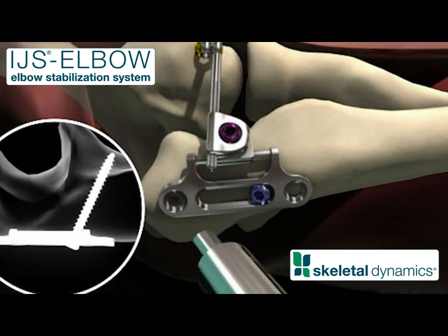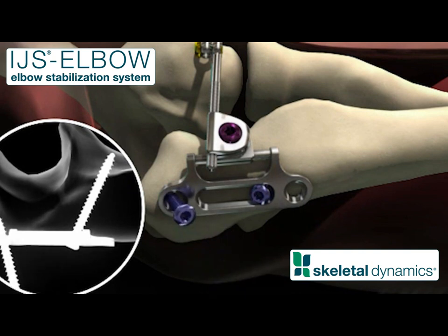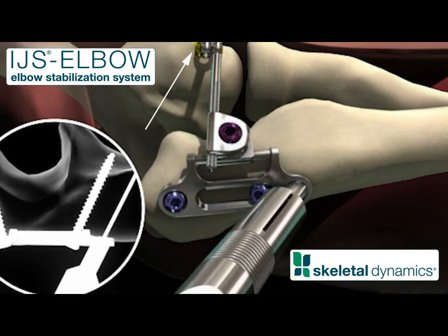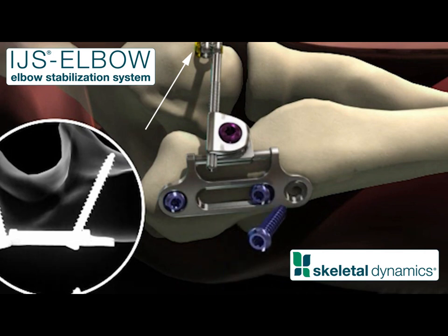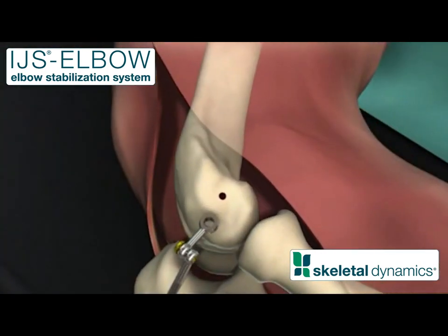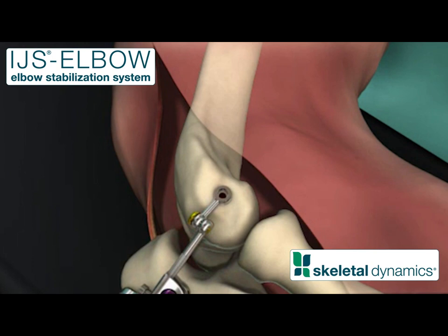Measure and insert a 3.5 millimeter self-tapping compression screw, avoiding the joint. Drill, measure, and insert screws into the proximal and distal holes of the ulnar plate. Assure that the humeral locking screw is pointing proximally to facilitate access.